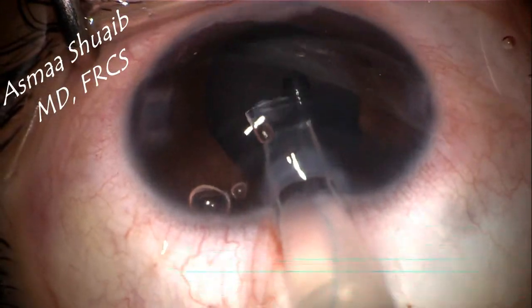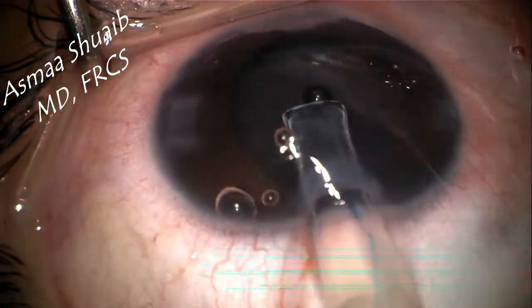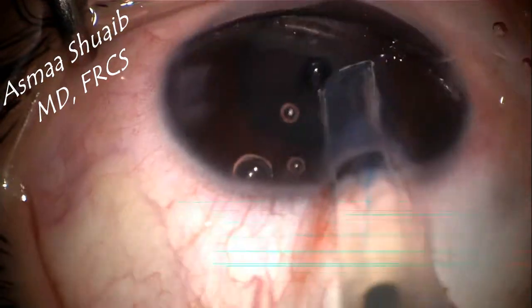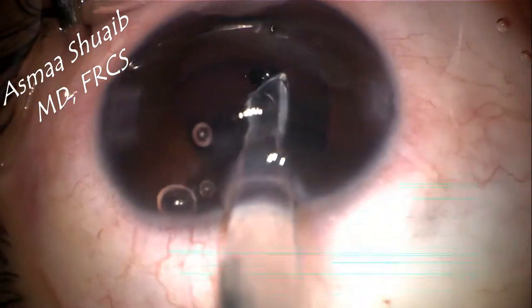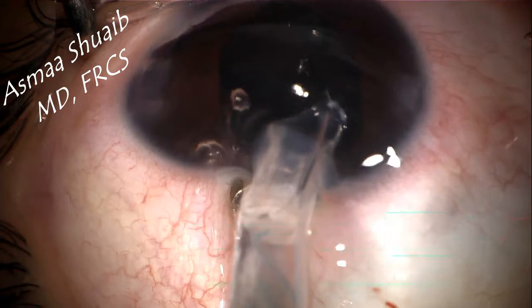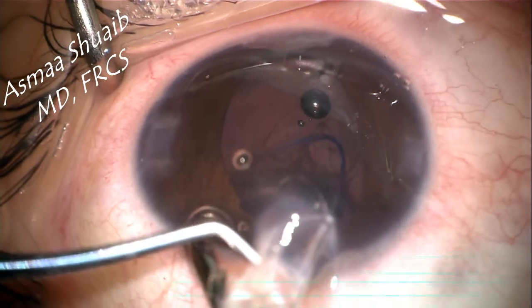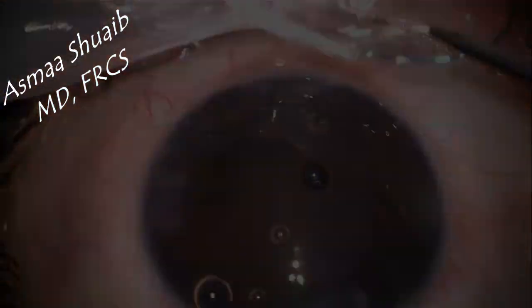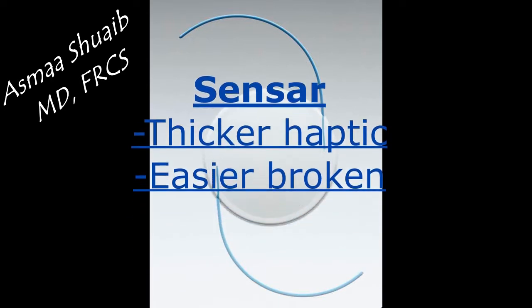In this case, a pre-loaded IOL was given to me by the assistant. I noticed that the leading haptic was becoming straight and there was lots of resistance while moving the IOL in the cartridge. In the end, a part of the cartridge herniated into the anterior chamber and I could not get the IOL outside of it. This happened due to mistakenly using a D cartridge with a smaller diameter and tighter space for a three-piece IOL.